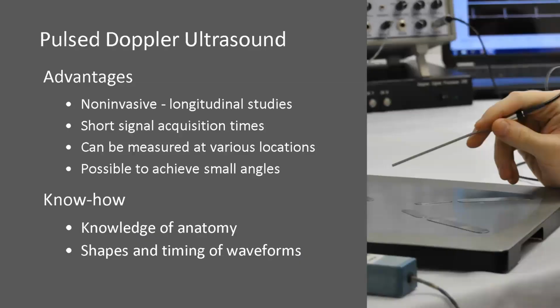So briefly talking about pulse Doppler ultrasound, what are the advantages? It's non-invasive, and so that allows us to do longitudinal studies. The signal acquisition times are short. These signals can be measured at various arterial sites, and we can do this by achieving very small angles. If you look at the probe here, this is very small compared with echocardiography probes.